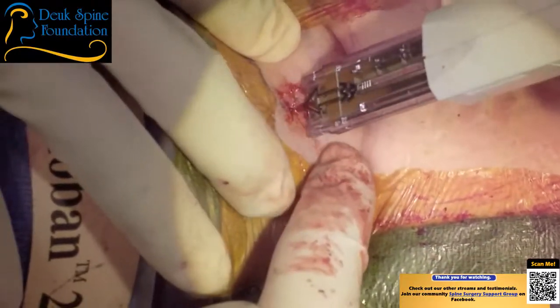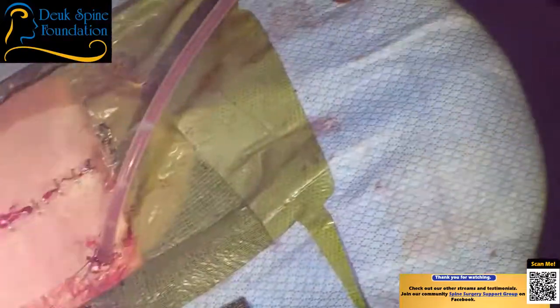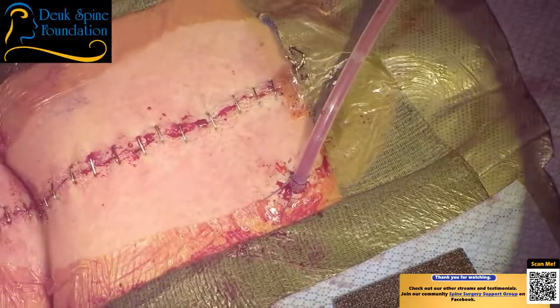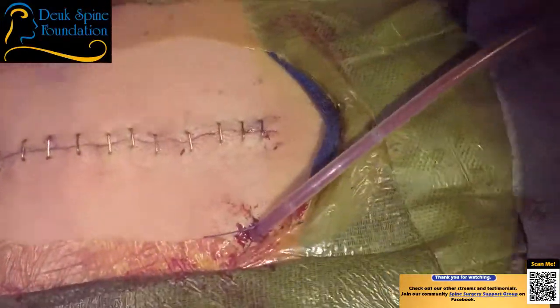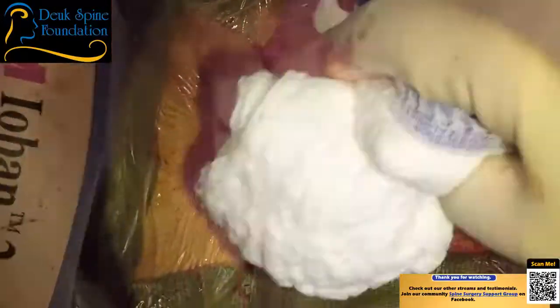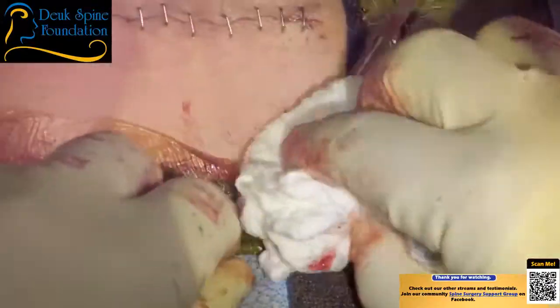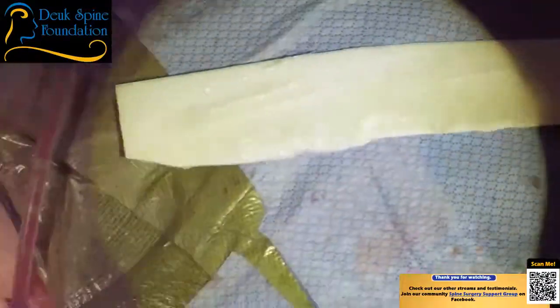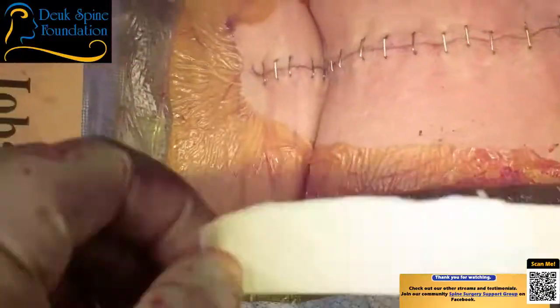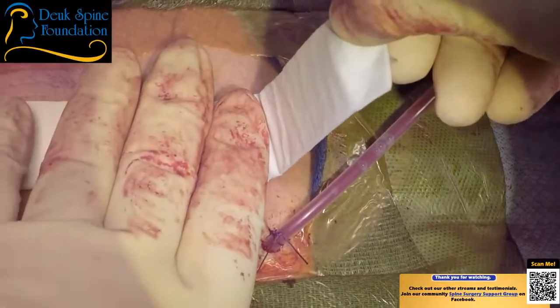Nice job, doctor. Thank you for your help. Wet dry? Well, let's get her recovered. Dry? You have a little polysporin. You have that, what's it called? Scissor? Do you have the little benzoin? Go ahead. No, we don't use that. Right above my finger.